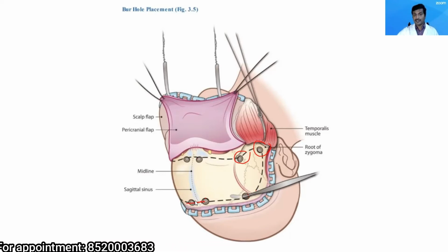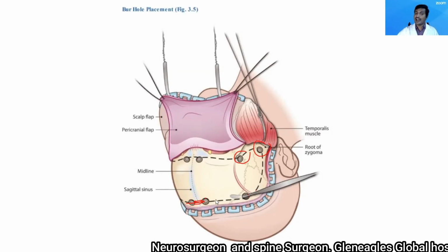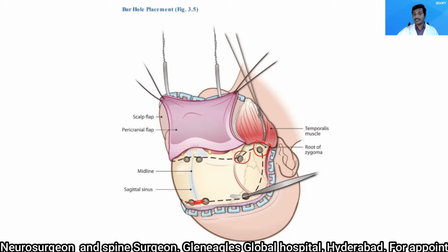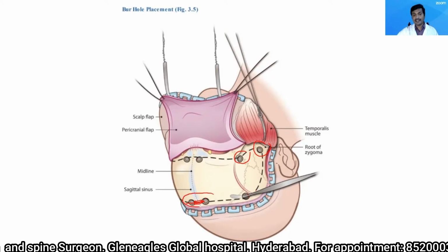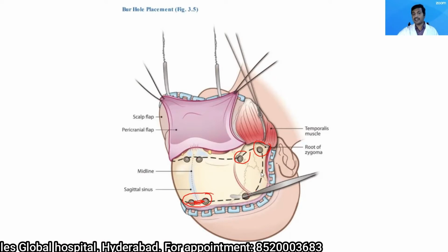Other people use a cutting burr followed by a diamond burr to make this bone papery thin. Once you make it papery thin, use a dissector or a 1 mm upcut to join both burrholes. This part of the procedure is done last, only after connecting all the burrholes with the craniotomy.